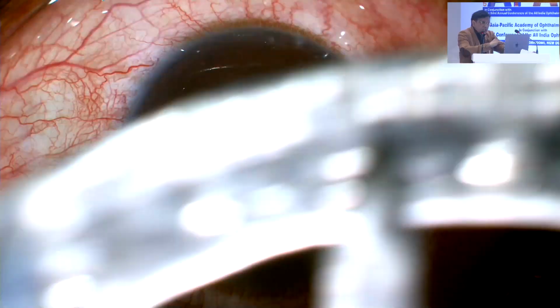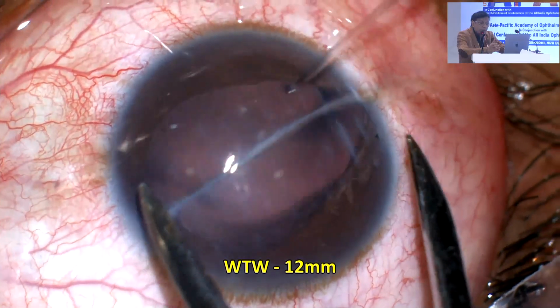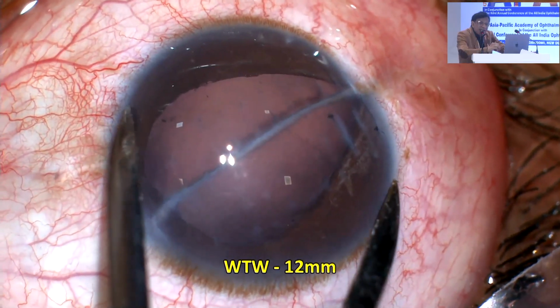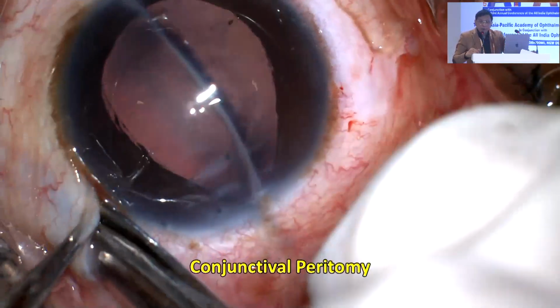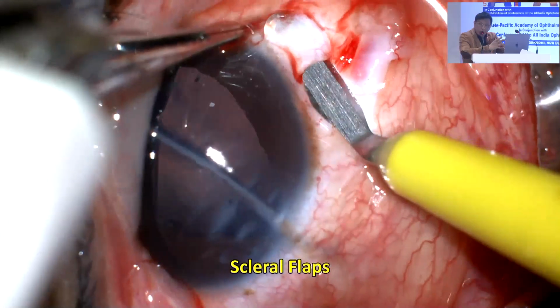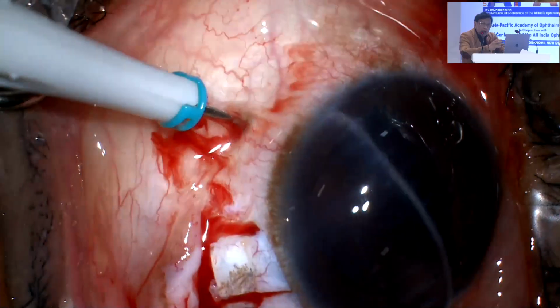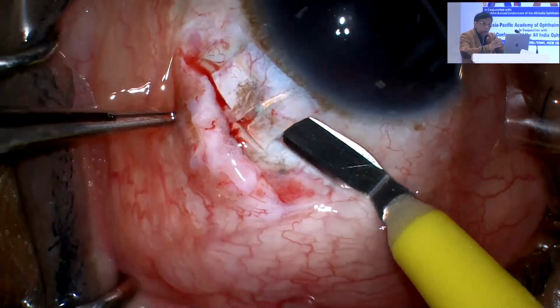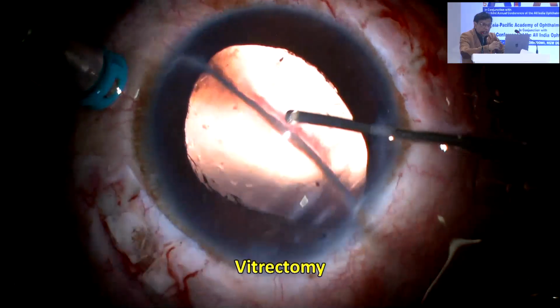Now, the patient has a scar right in the center. The question comes, now how do you manage it? There's no capsule worth the name obviously there. Normally, we'll say go for a penetrating keratoplasty. And what we have started doing is cases like these, where you have scars, where you have even opacities, and I'm showing central scarring, which peripheral is easy, I'm trying to avoid a penetrating keratoplasty. So once I have made my scleral flaps, obviously I'll need to fix an IOL in this case.